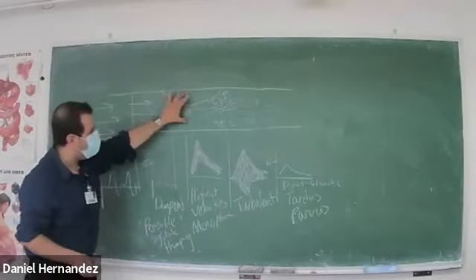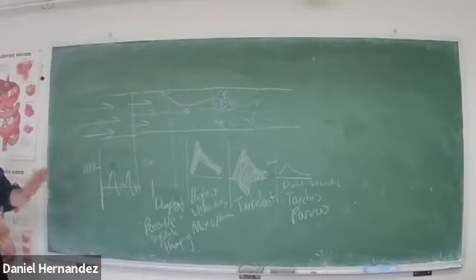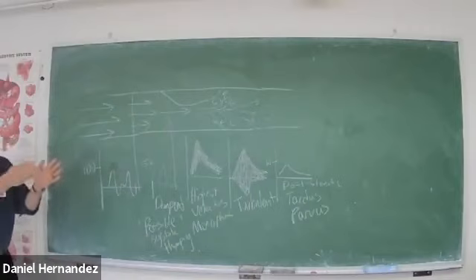Depending on how severe this blockage is, we may start to encounter that systolic thumping, where we don't have any sort of diastolic component, and we just get that little systolic thump, basically every time the heart beats, we get forward flow, and that's it.